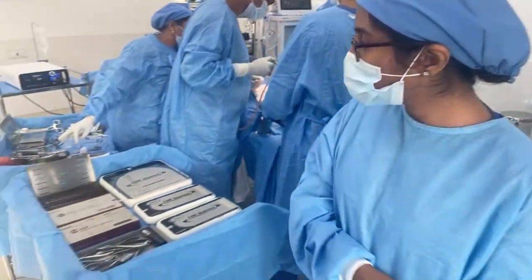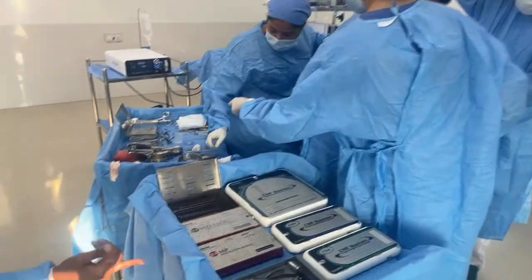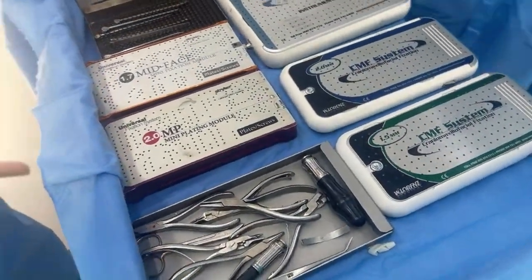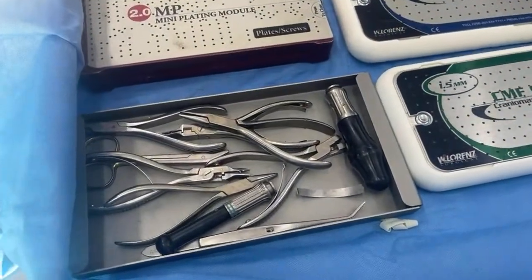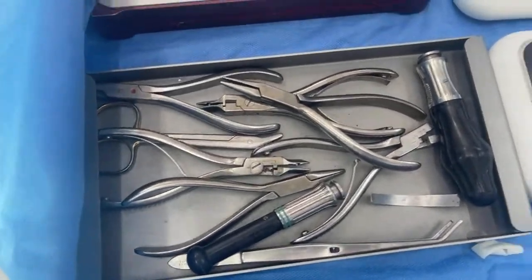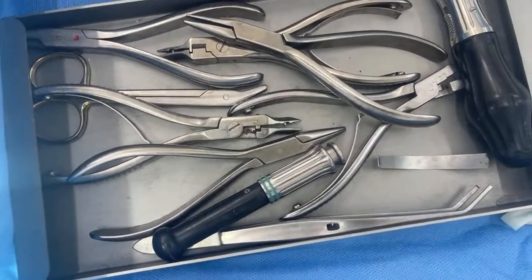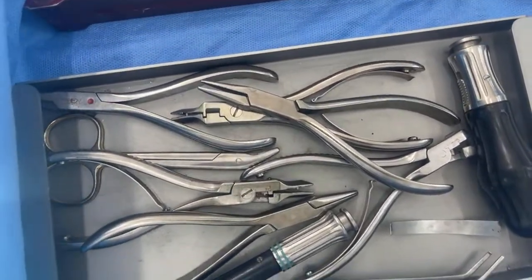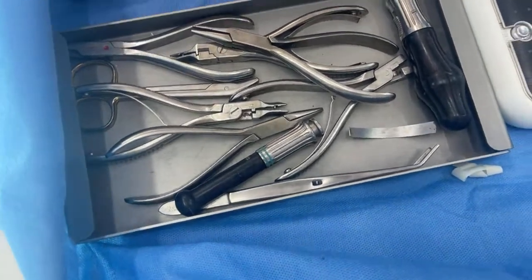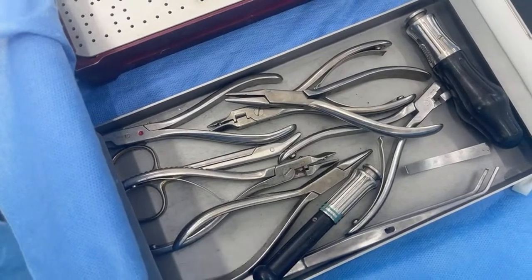Now I'll show you the basic surgical instruments which are being used. You see here a lot of plate benders, and some forceps to hold the plates on while we are fixing them. In case you have any doubts regarding the surgical procedure, you can post your comments.